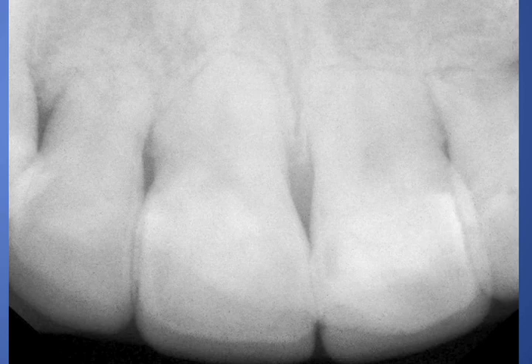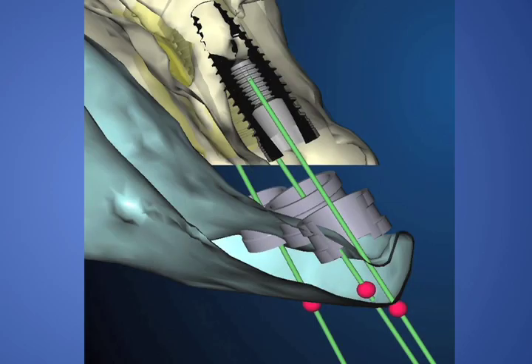As I mentioned earlier, we weren't necessarily concerned after extraction of those teeth to place implants in those socket sites because we would obliterate those sockets completely. The CT scan was very, very important in this case to determine whether or not we could actually do this case successfully and predictably.